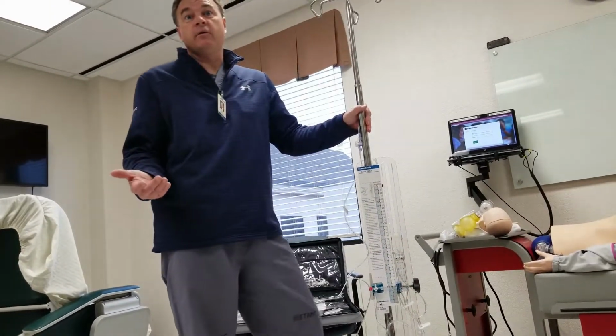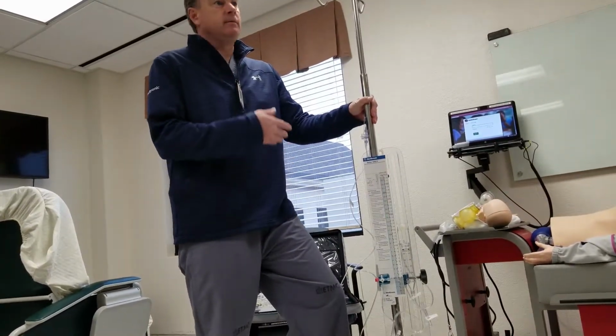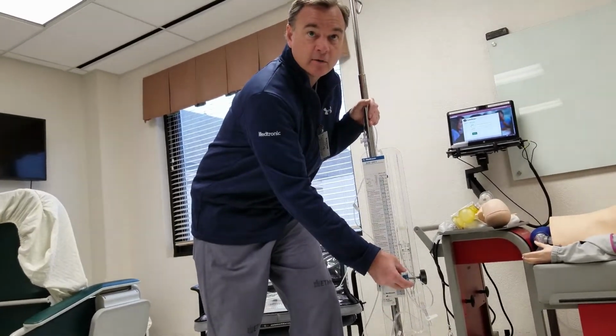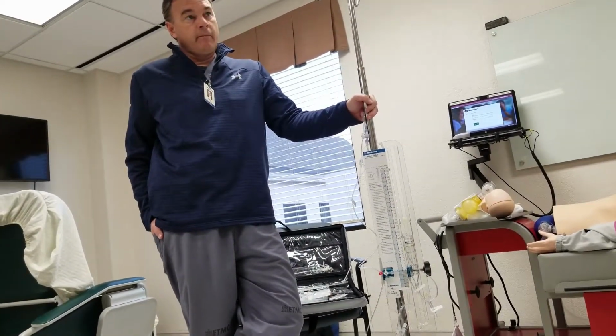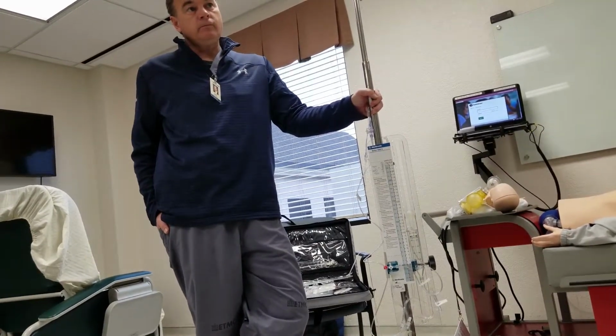So if it's every 4 hours, or every 2 hours, or every hour, you come in and you say, patient produced 13 mLs of CSF. Okay, perfect. You chart it, you open this up, and you restart, you zero this out. And typically your order is going to look like every hour drain 10, or every 2 hours drain no more than 20, something like that.